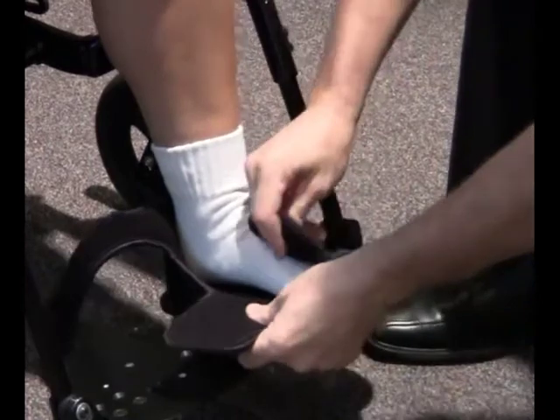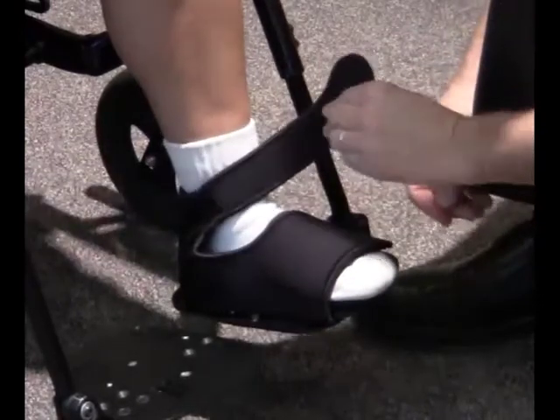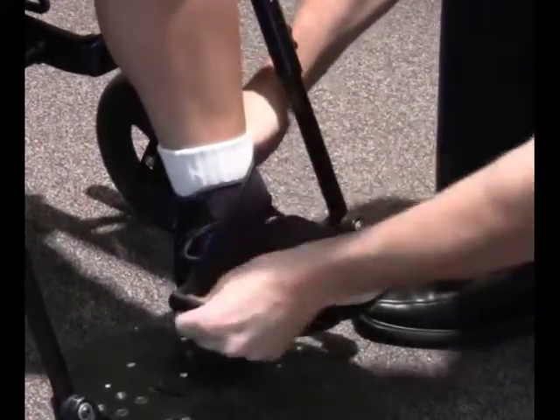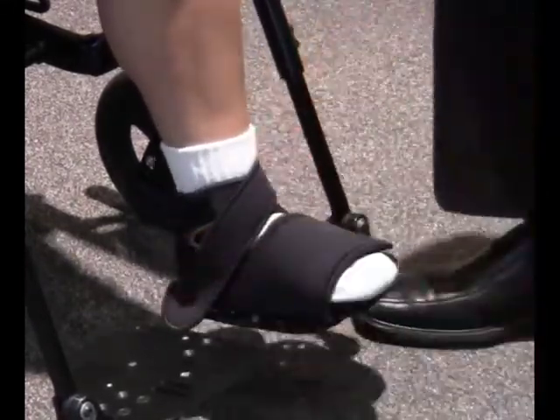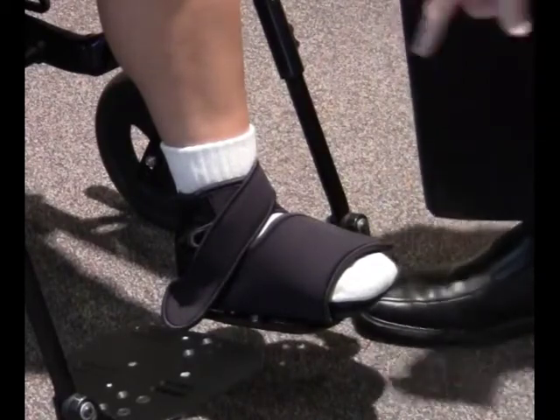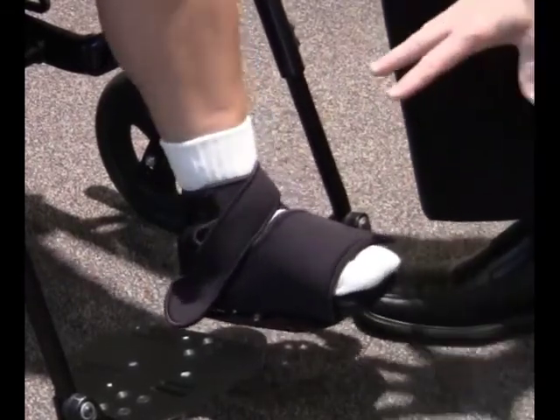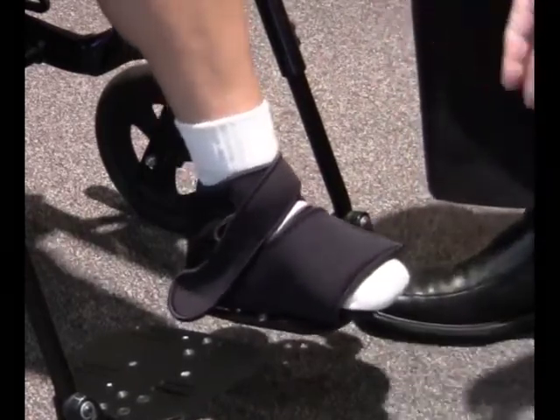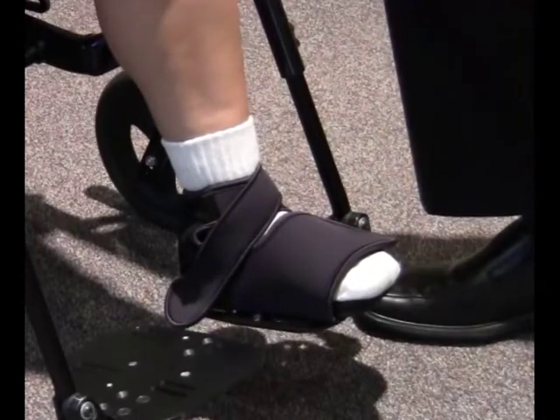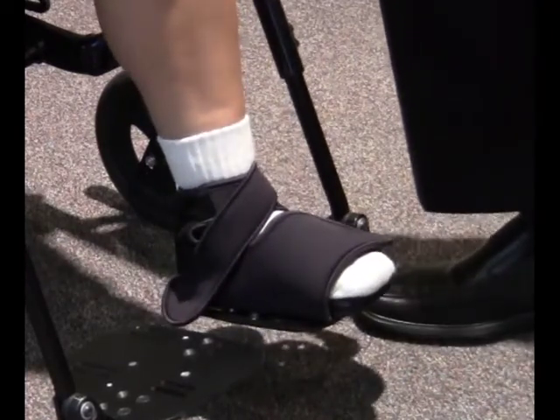With everything in place, we take and come across the front and lock it down. Then we take the back straps, come across the ankle, and Velcro to the base — bring this one across and Velcro to the base as well. You can see that the ankle is firmly locked into place. You still have some dynamic movement from front to back and side to side, but clearly that ankle is locked down and it's not going to let the heel come out because of the support in the back. The straps on the front lock you into that heel cuff.